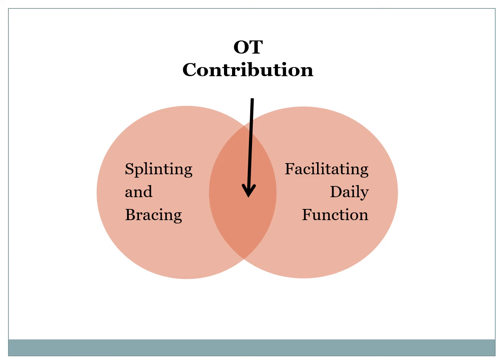As discussed earlier, OT in Tullamore only offers a bracing service to confirmed and documented stable spinal vertebrae fractures. However, we also offer spinal precaution education regardless of the type of brace the person is fitted with. The education provided to patients in respect to applying spinal precautions to activities of daily living following hospital discharge helps minimize pain, optimize independence, and promote optimum healing.